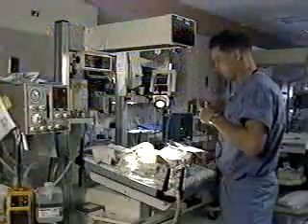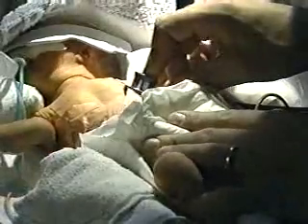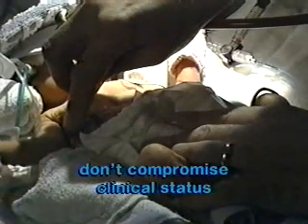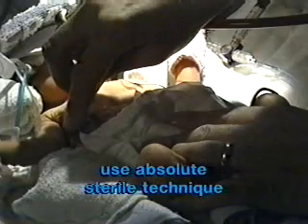Performing any kind of medically required procedure on an infant requires critical evaluation of the baby's clinical status and weight or size. In the lumbar puncture procedure, this is especially important as it relates to the development of the infant's spinal cord. When performing this procedure, it is critical to know your landmarks and not to deviate from them, to not compromise the clinical status of the baby, and additionally, to use absolute sterile technique.